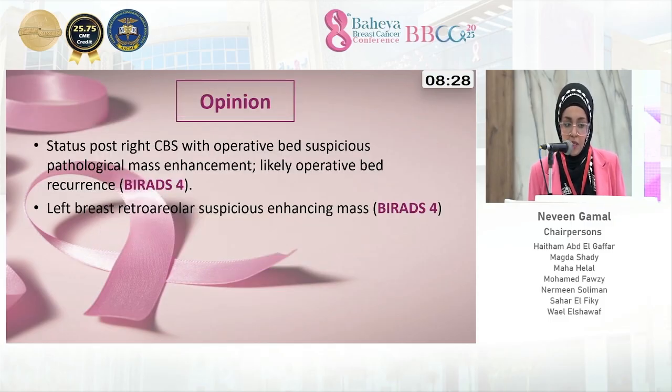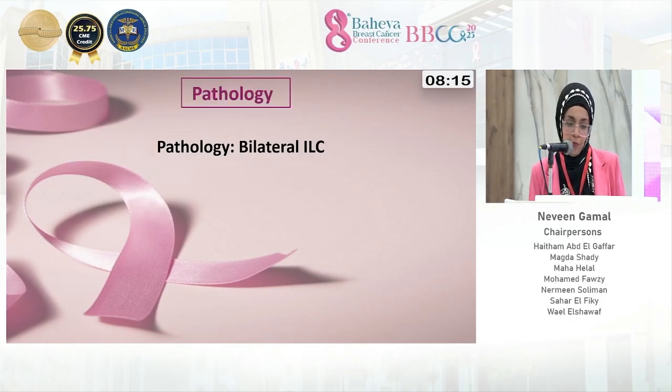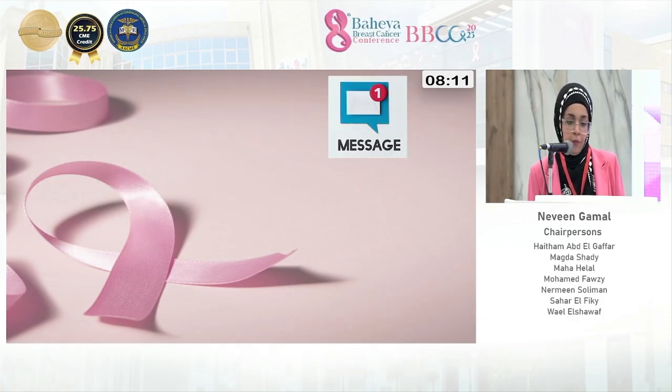So our opinion in this case was status post-conservative surgery at the right side with operative bed suspicious pathological mass enhancement, likely recurrence by BI-RADS 4, with left breast retroareolar suspicious enhancing mass also by BI-RADS 4. And the pathology came with bilateral invasive lobular carcinoma.